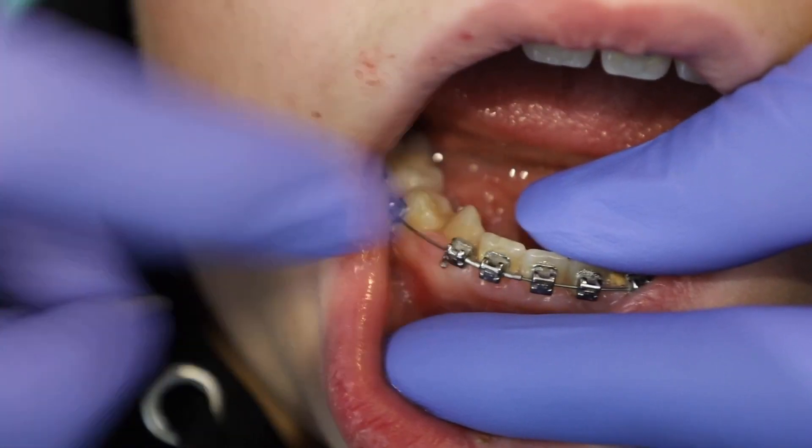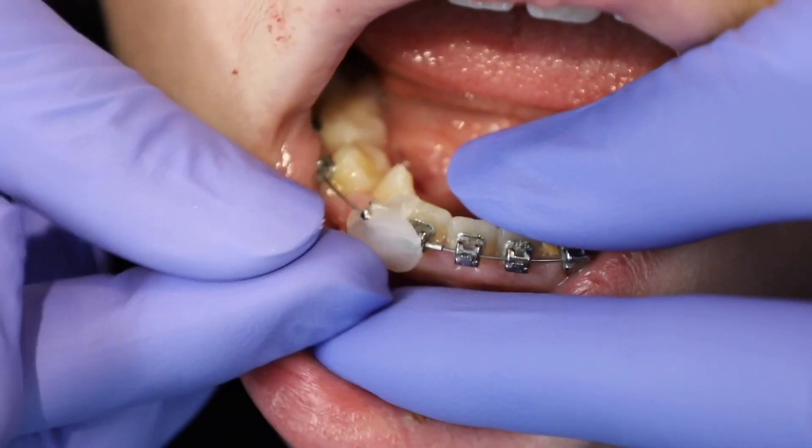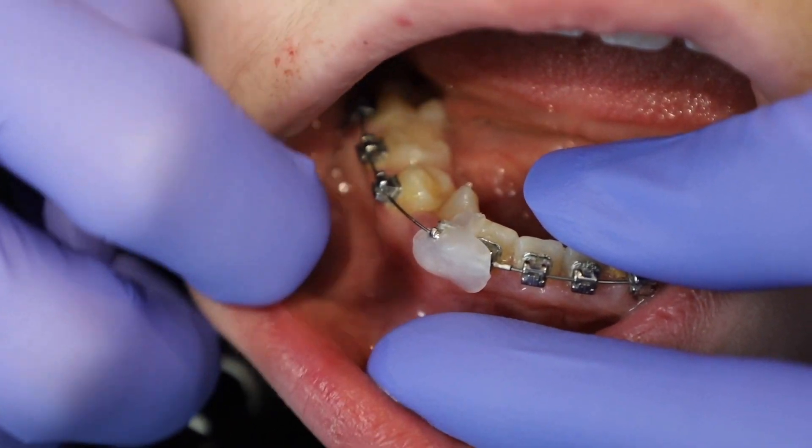Simply take the wax, press it toward the bracket next to it, and place the wax over it. That will last pretty much the whole day and even the next day until you can get to see us next time.